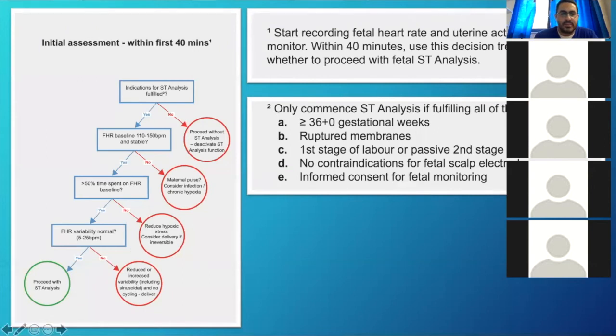Because the baby is more likely not distressed at the time, and the machine is going to determine the baseline of the fetal cardiac well-being. This machine is going to take the baby's status that you're starting at as the baseline, for whatever changes happen. So if you're starting with a baby that's already stressed, or a baby that is deteriorating really fast, then you won't be able to assess the baby using STAN, and you'll be falsely reassured by the fact that the STAN is not alarming.